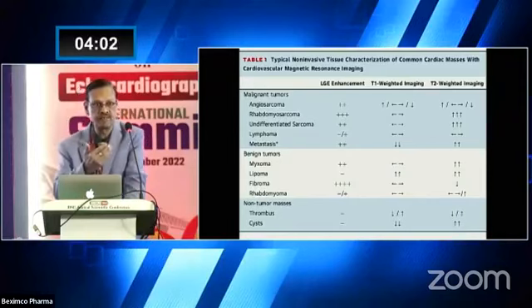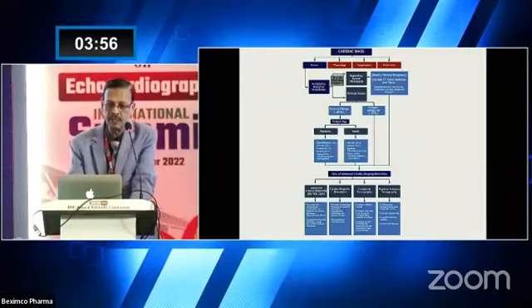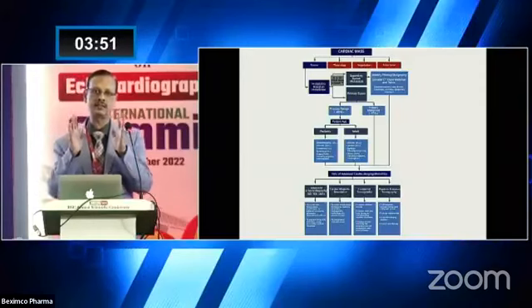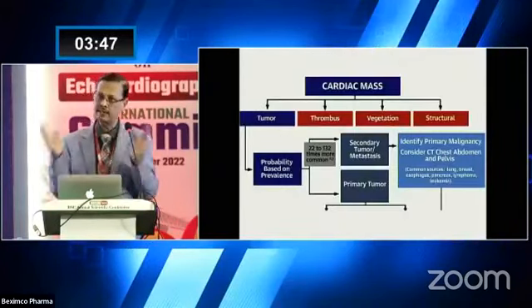And we can stratify the different cardiac tumors with the CMR. And the last two slides are very important for any case of cardiac mass. You follow this flowchart. You cannot read it on this slide, so I increased the slide.